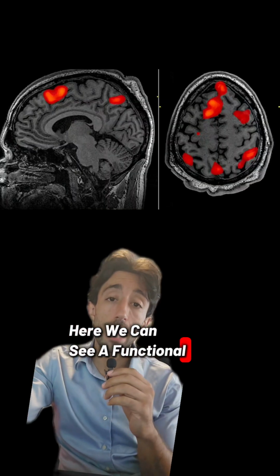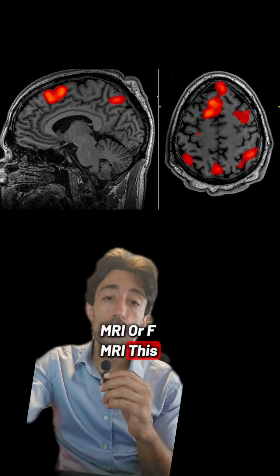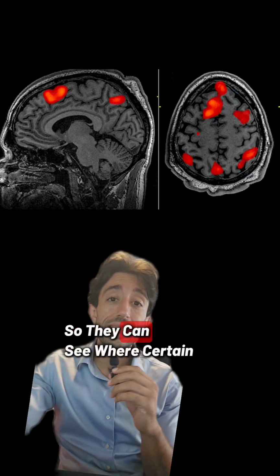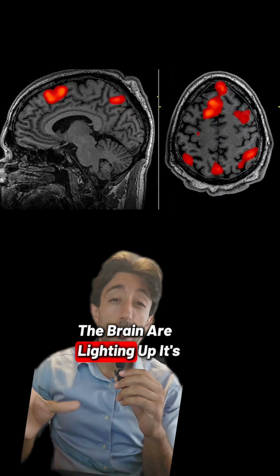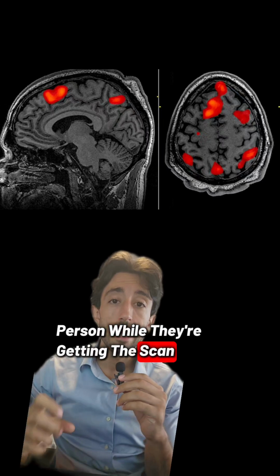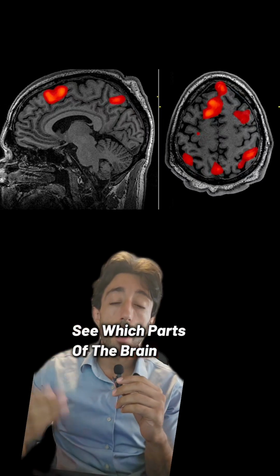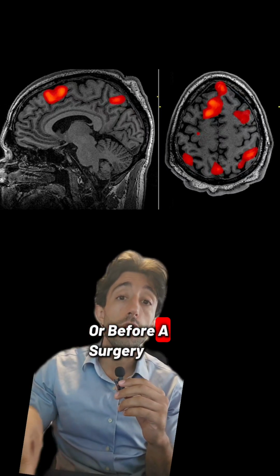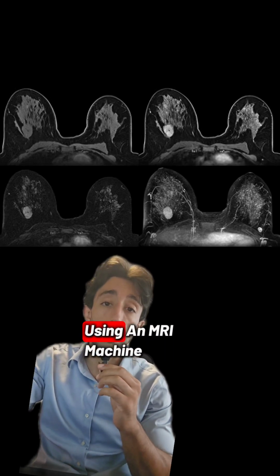Here we can see a functional MRI, or an fMRI. This is usually taken where there are specific tasks given by the doctor so they can see where certain areas of the brain are lighting up. It's quite a cool thing when you think about it. The doctor will talk to the person while they're getting the scan to see which parts of the brain are being affected. And a lot of the time this is going to be taken either for research or before a surgery.